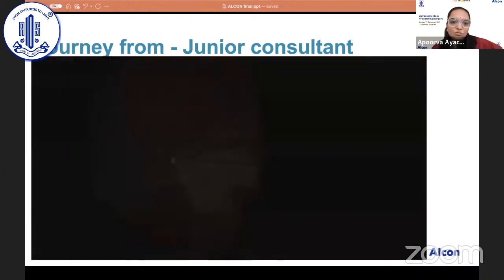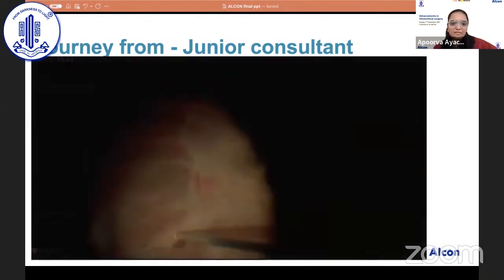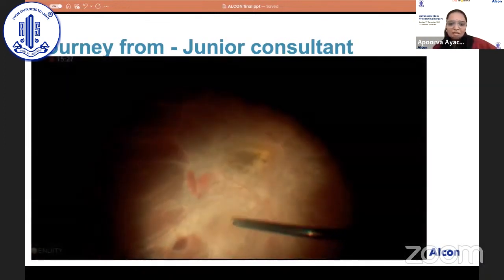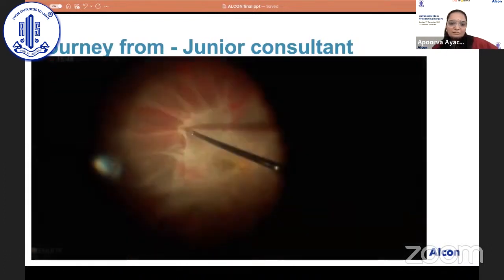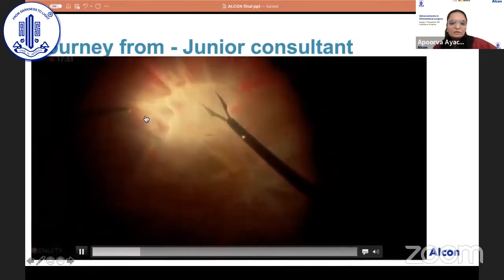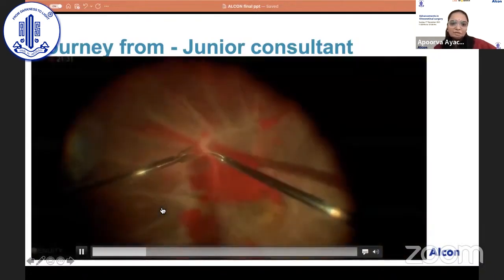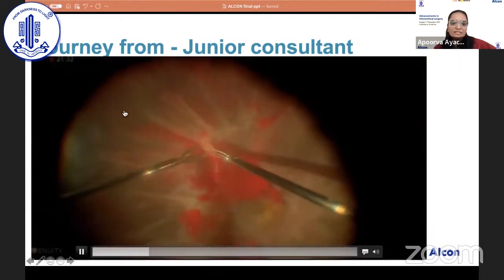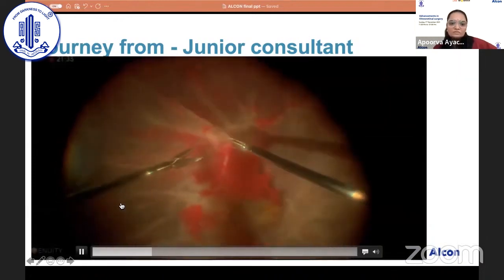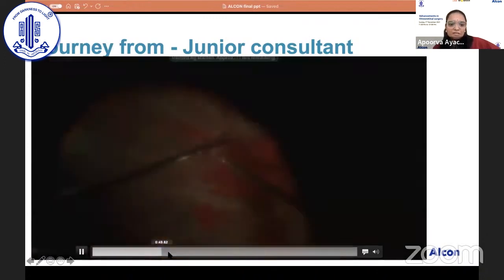And I'm itching to know what senior panelists, Sarunan sir, Mighty sir, and Manisha ma'am have to say about this. I mean, give me pointers on how to manage such cases. You can see that this very thick fibrous tissue is completely adhered to the retina, and the retina around is extremely thin, with sclerosed vessels everywhere. Yeah, I'm doing a bimanual surgery.